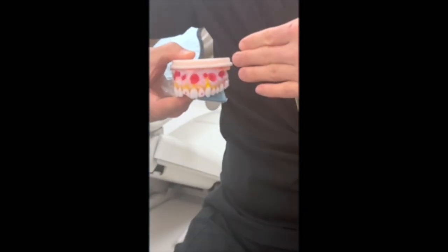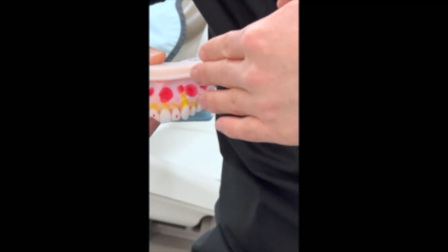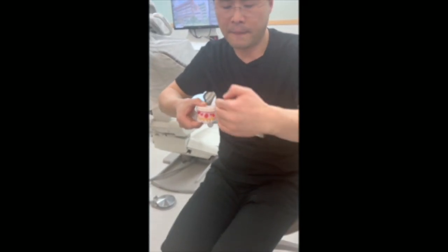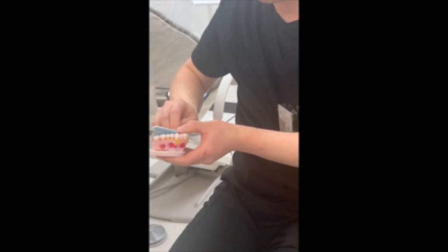So if you take it mesially the first time, you'll switch it distally. It may even look like that you're taking it directly at the canine, but this off angle will give you a visualization as to whether it's single or double rooted.